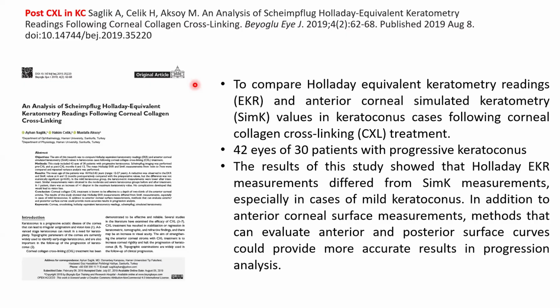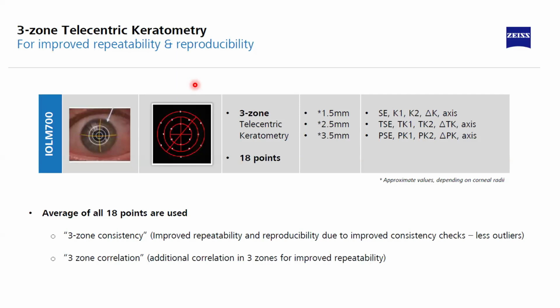So that was the part on Holladay EKR, sir. I have a few slides on the IOL Master TK also. Sure.